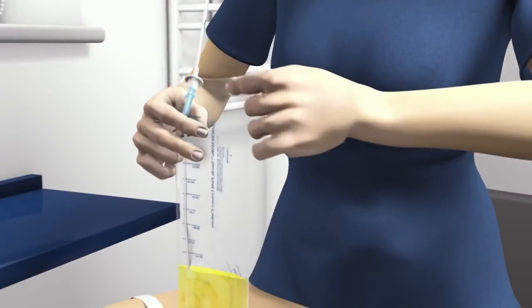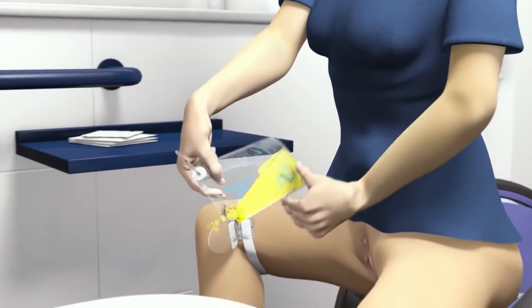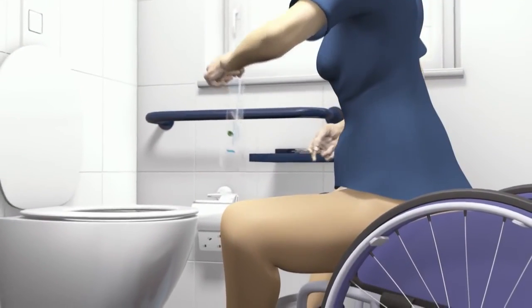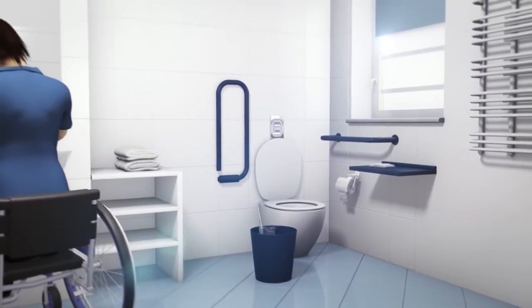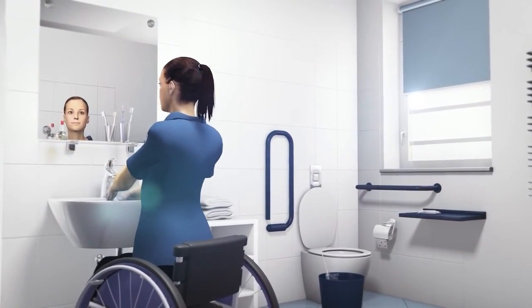Grasp the bag at the corner where it says, "Tear here to empty," and tear the bag gently down towards the middle of the bag. This will allow you to dispose of the contents without any mess. Pour the urine into the toilet. Dispose of in a proper trash receptacle. Finally, wash your hands again.